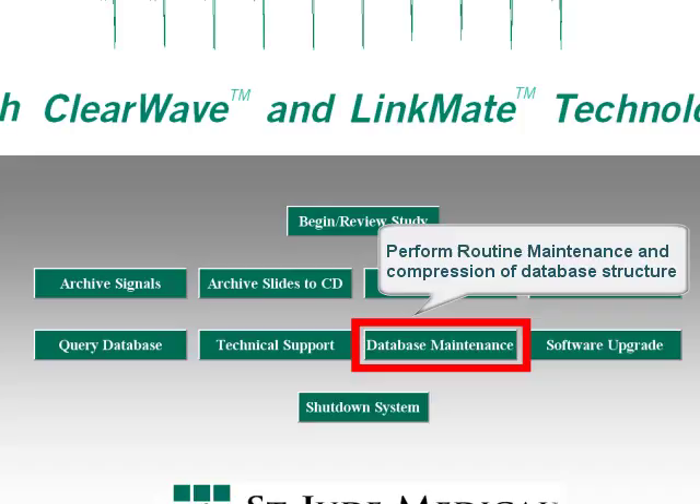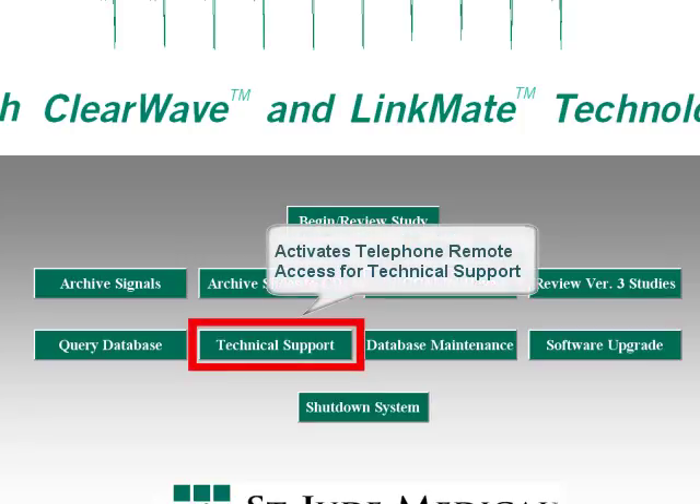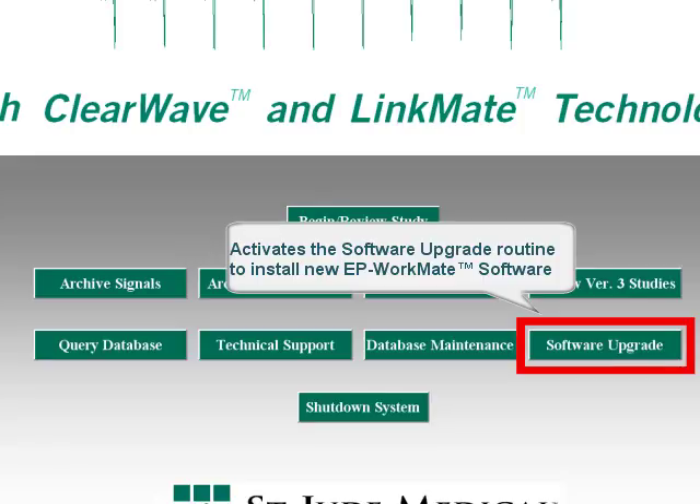Database maintenance is a utility that performs routine maintenance and compression of database structure. To run the database maintenance, you simply click the database maintenance button and allow the utility to run. Depending on the amount of information in the database, it may take a few seconds up to approximately a minute. The Technical Support button activates PC Anywhere, which is the program used for telephone or Internet technical support. The customer must press the Technical Support button in order for remote access to the computer.